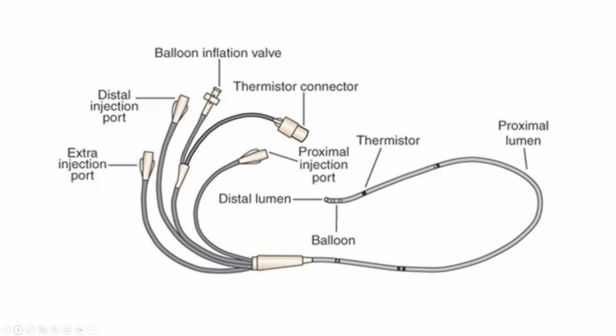It's not so much knowing that, even though when I took the ACCS exam, they actually had information regarding the Swan, that the millimeter marker was X, in other words, where it was secured. I remember scratching my head. The point they were getting at was that it was not properly positioned. The distal lumen was not positioned where it should have been in zone 3 of the pulmonary artery. It was not advanced enough. And the key was they actually told you at what point it was secured, so it wasn't advanced enough.